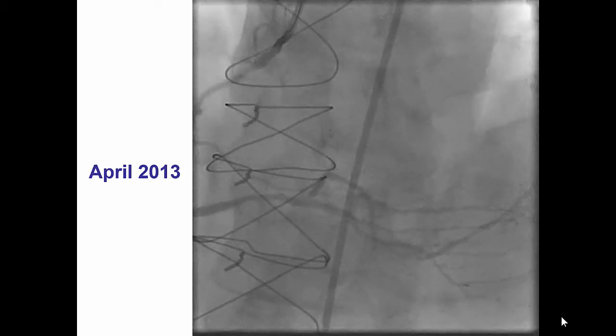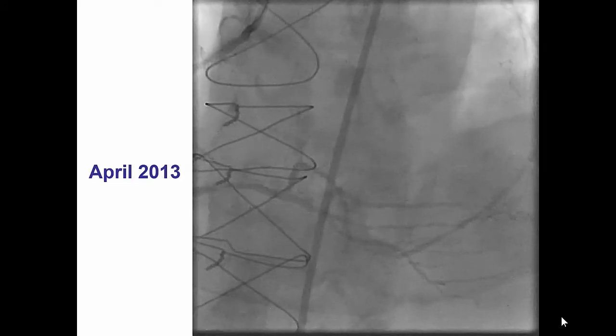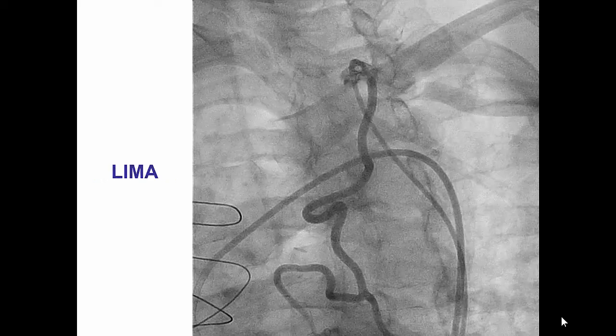The patient had PCI a few years prior to the current presentation with stents in the proximal right coronary artery, however presented two years later with a complete occlusion of the proximal right coronary stents. There was no stump on the proximal vessel, making antegrade treatment extremely challenging since there is no stump to get guidewire escalation started.